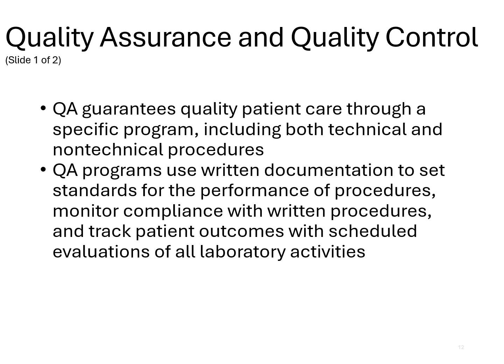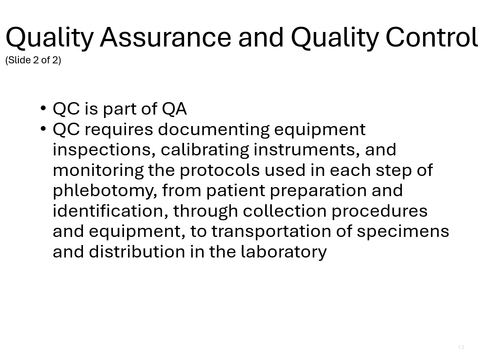If there is a problem, documentation will help to provide a means of monitoring the actions taken to help resolve that problem. So if we run into an issue, we have documentation, we can go in and try to get down to that root cause to figure out what is actually causing it and make it better. QC is part of the QA. So QC requires documenting equipment inspections, calibrating the instruments, and monitoring the protocols that are used in each step of phlebotomy, from patient prep and identification all the way through the collection procedures and equipment, and then all the way to the transportation of specimens and distribution to the laboratory.